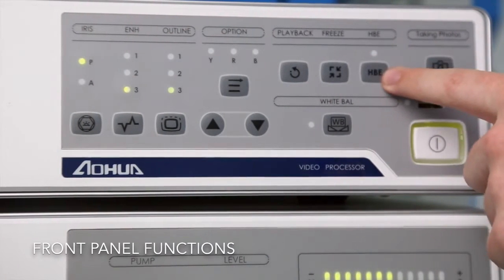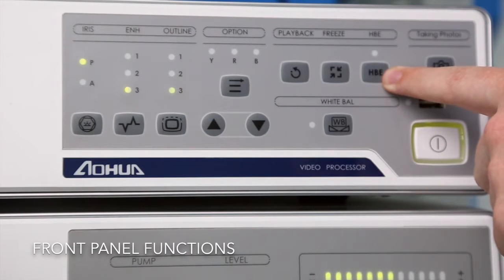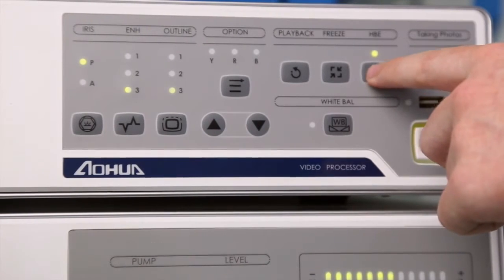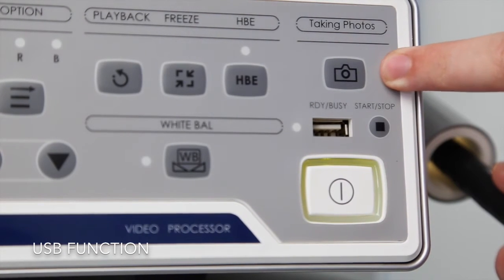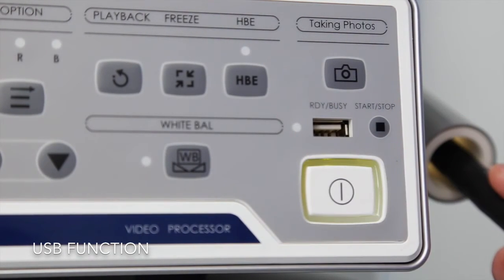This is the hemoglobin function, which is used to enhance the blood vessels and cells. And this button is used for taking photos when the USB stick is inserted.